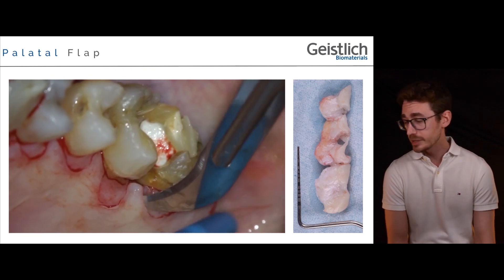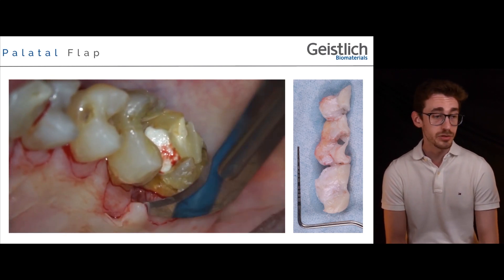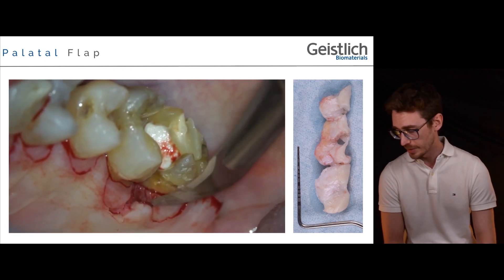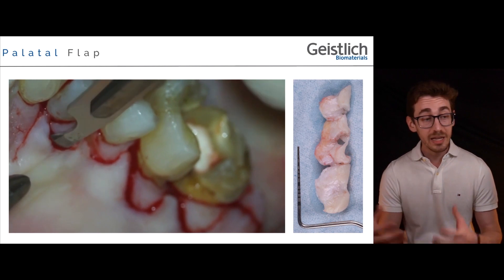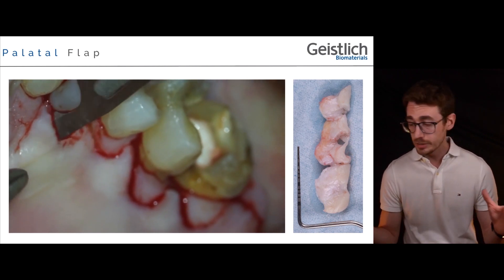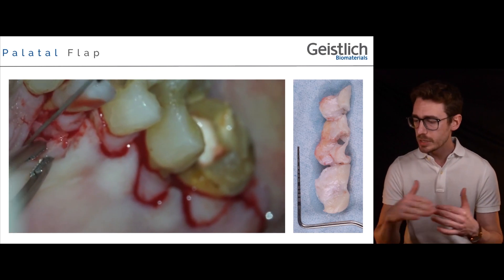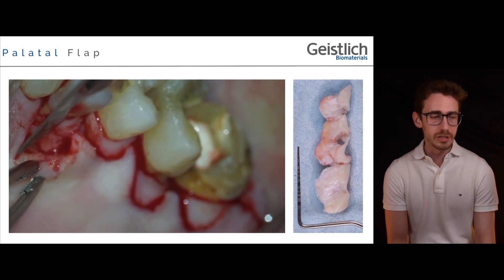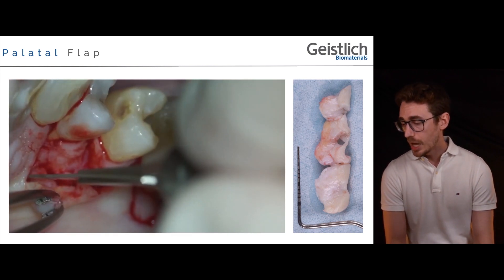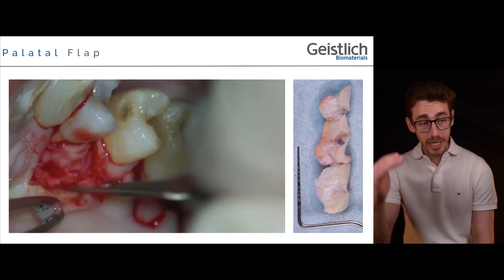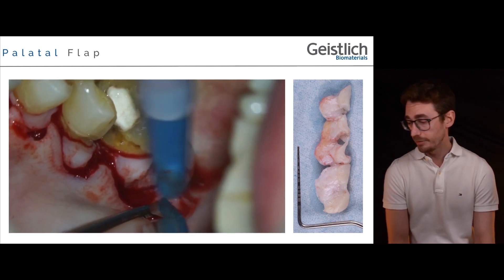In this flap design, the distal wedge is essentially a large surgical papilla, exactly as the surgical papillae we see interproximally. We elevate each surgical papilla split-thickness, and once every papilla has been elevated, we move to the split-thickness dissection of the palate, maintaining an even plane of dissection by keeping the blade parallel to the bone until we achieve the adequate depth to obtain our thin palatal flap.